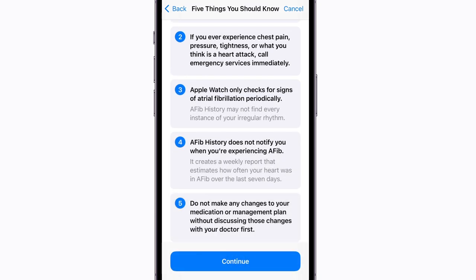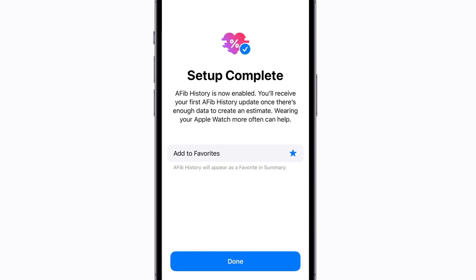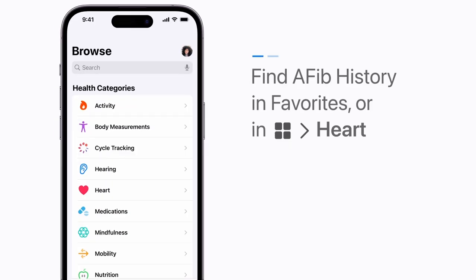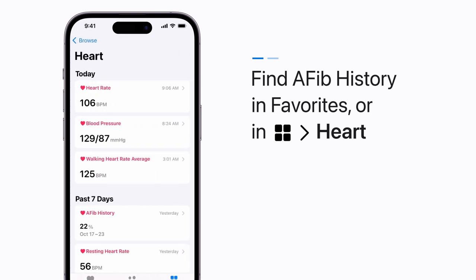When you're done, AFib History is automatically added to your Favorites in the Summary tab. Results will appear after about a week of wearing your Apple Watch for at least 12 hours a day. Find AFib History in your Favorites or in the Browse tab under Heart.